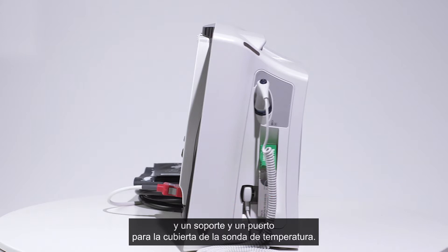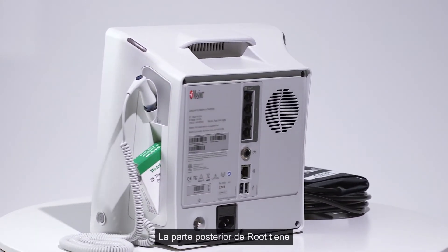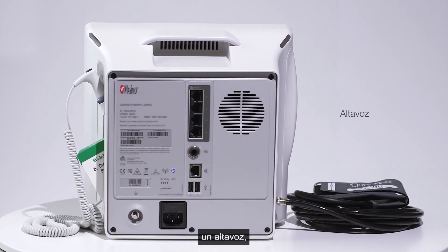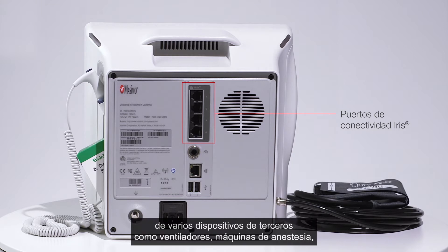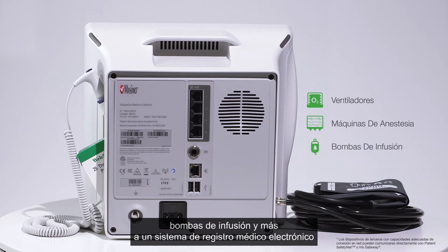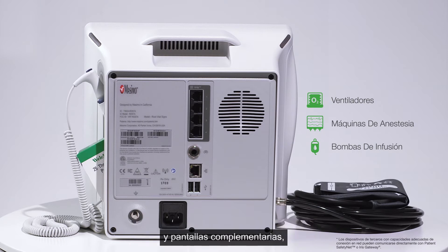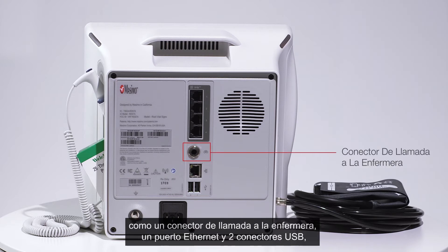The back of Root includes a handle for easy portability, a speaker, and iris ports enabling connectivity to transfer data and alarms from numerous third-party devices — including ventilators, anesthesia machines, infusion pumps, and more — to an electronic medical record system and supplemental displays. Additional ports include a nurse call connector, an ethernet port, and two USB connectors.